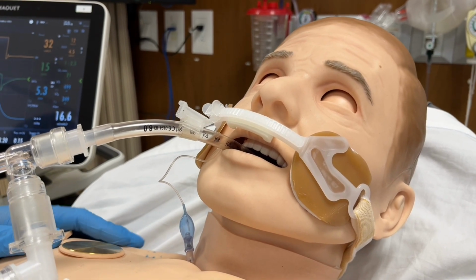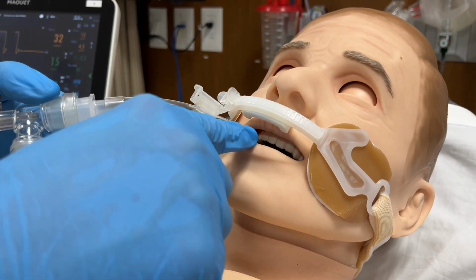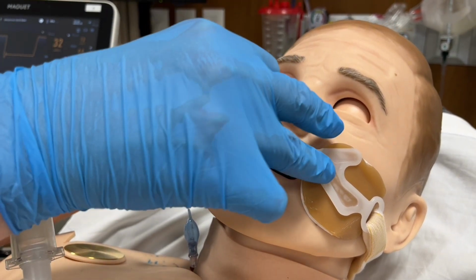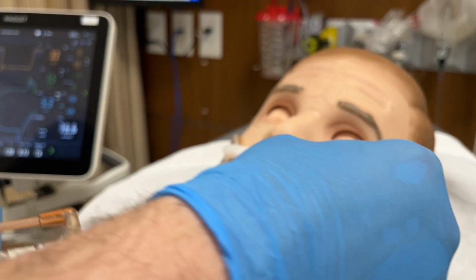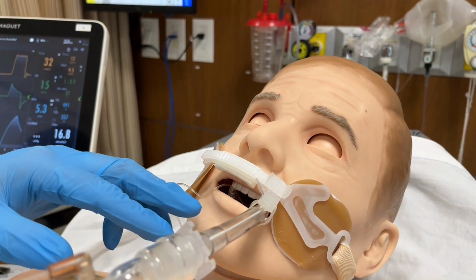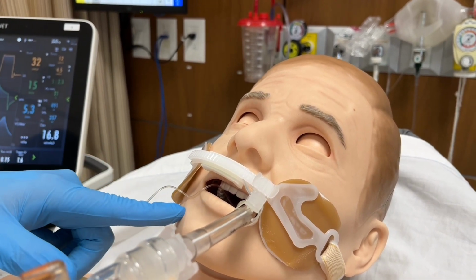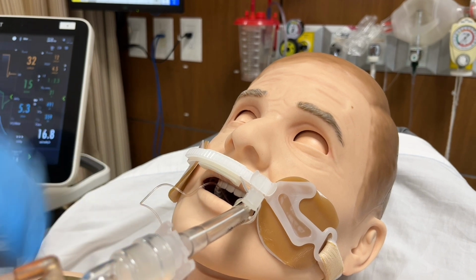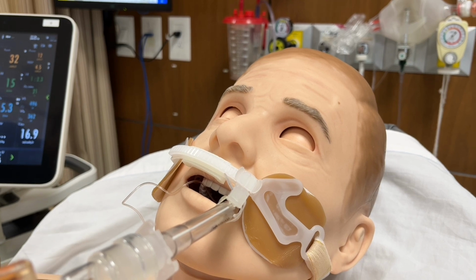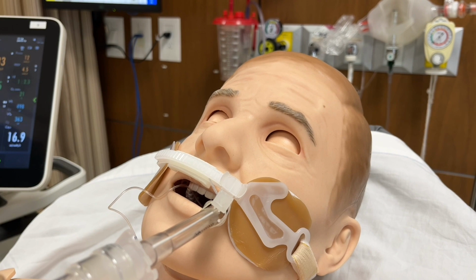We want to inspect his endotracheal tube. We want to inspect the size of the endotracheal tube, where it is at the teeth, and we want to move the endotracheal tube to ensure that we can complete mouth care. Other reasons to move the endotracheal tube is to ensure that no breakdown of tissue can occur to reduce that risk. We're going to inspect the mouth to see if there is any tissue breakdown occurring. When we complete this, we do want to check with our monitoring record to ensure that the patient still has the endotracheal tube at the same placement at the teeth that they were last checked.